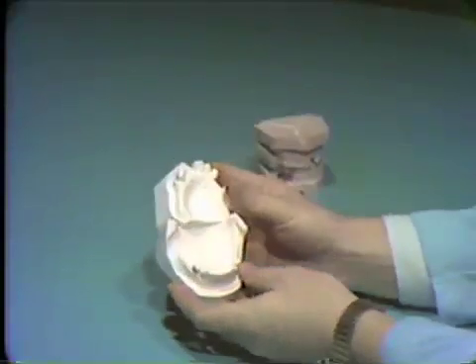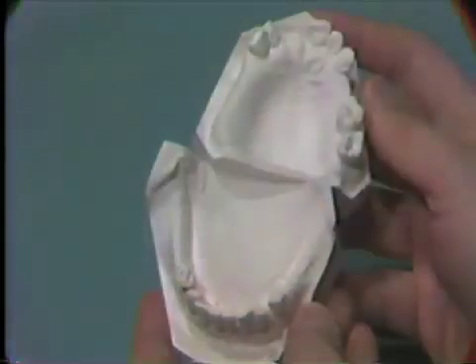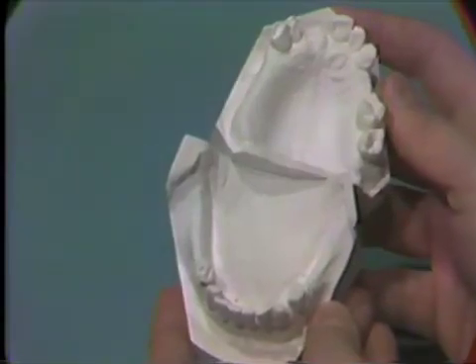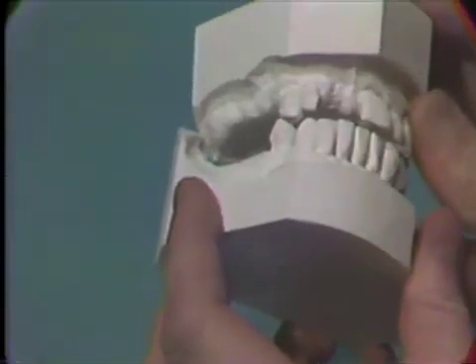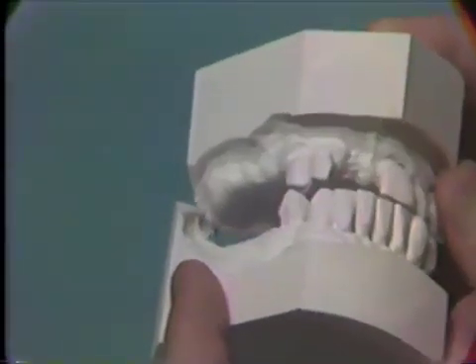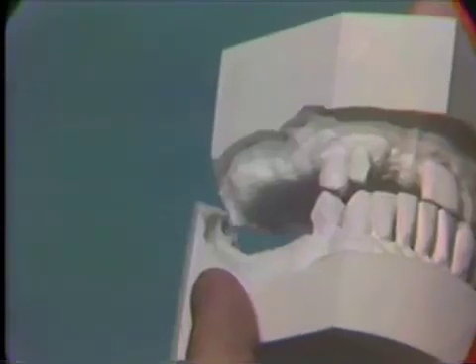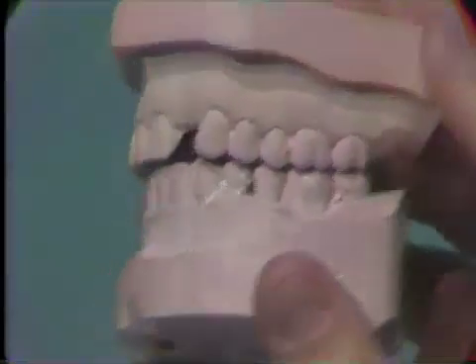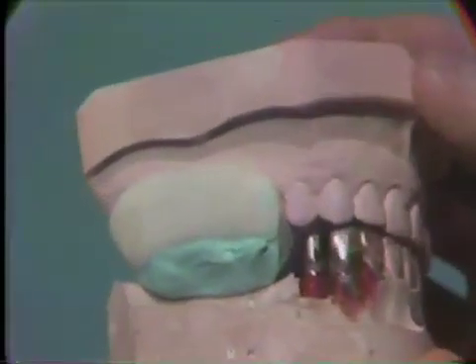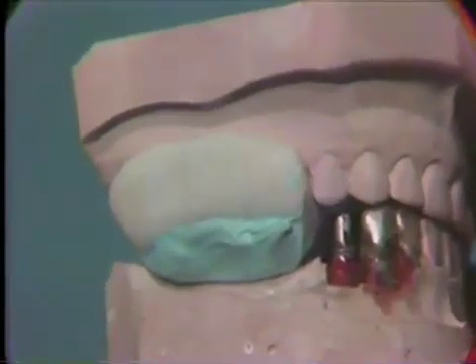In some cases of partial edentulism, where there are no posterior teeth in both arches, it is necessary to construct maxillary and mandibular stabilized base plates, register the vertical dimension and centric occlusion on the patient, and transfer this relation to the articulator. On this technic model, inasmuch as there are teeth opposing each other on one side of the arch and teeth opposing the lower edentulous space on the other side, it is simpler to construct a bite block for the edentulous side and use the occluding teeth on the opposite side.